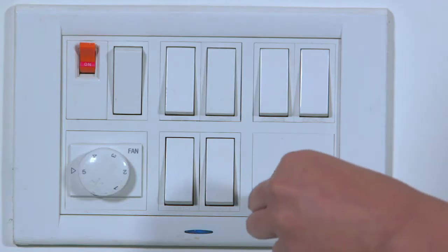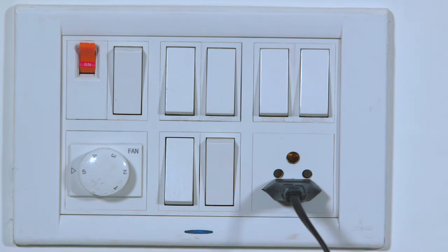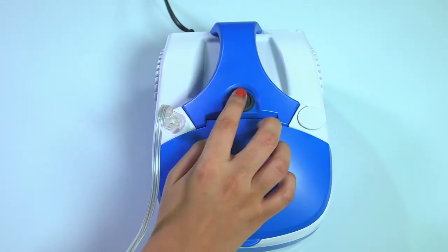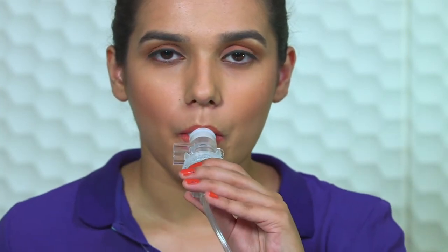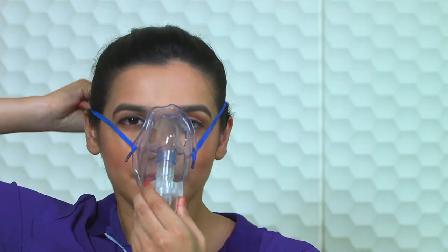Insert the power cable into a power outlet of appropriate voltage and turn the power on. The liquid medication instantly turns into fine mist, which is the aerosolized medicine and is ready to be inhaled. Use the mask or the mouthpiece as per your convenience.